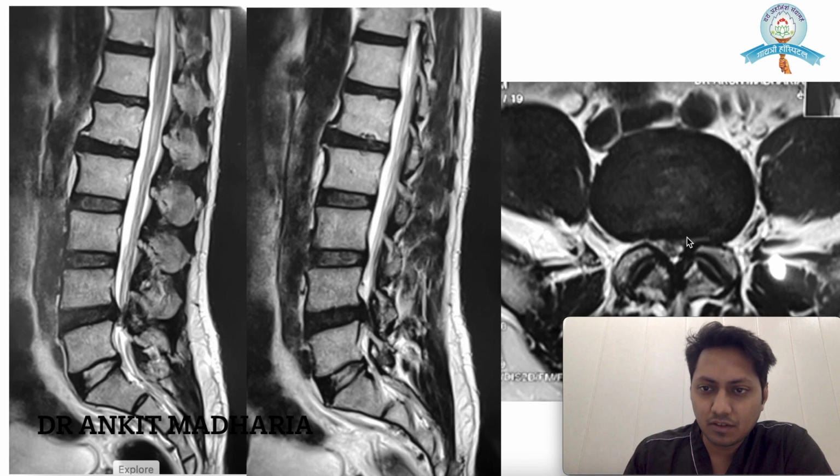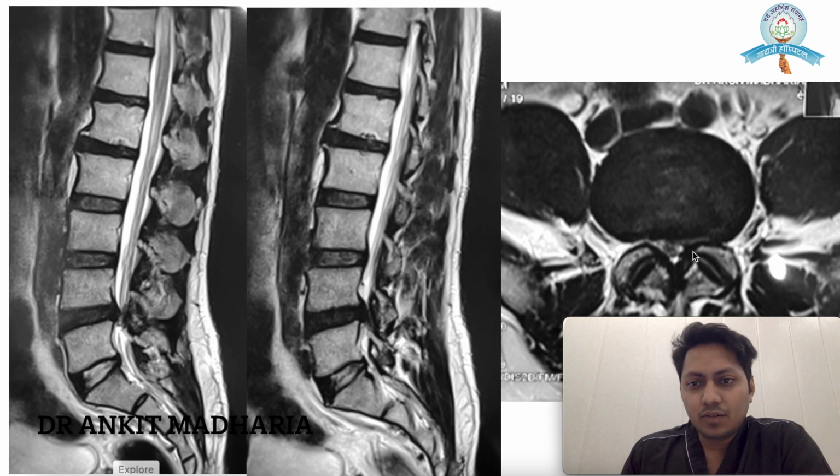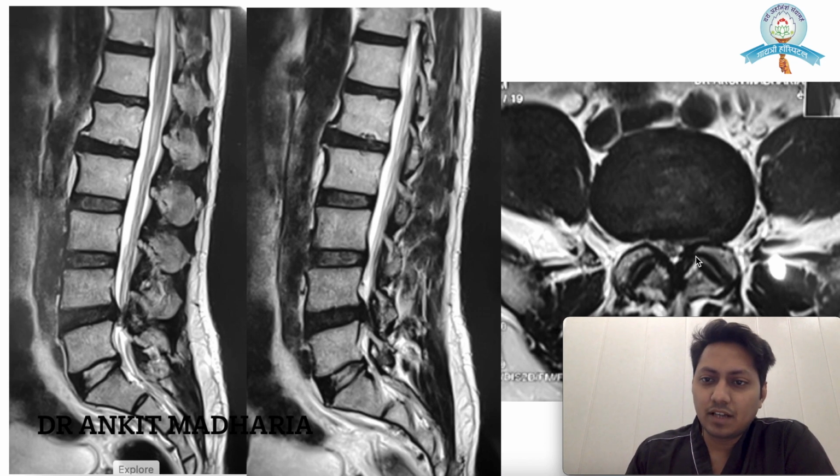You can see that the traversing root over here is mainly compressed by this bulging disc and this part of ligamentum flavum. Now I need to stress here that by the three zone and three wall concept, the ligamentum flavum lies just on the inner surface of the facet right over here, and that is the main cause of stenosis.